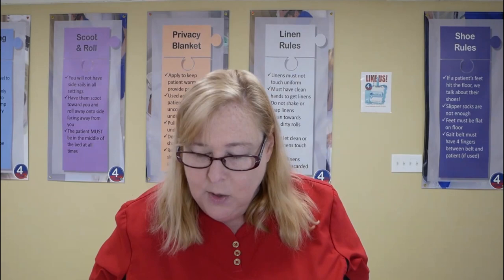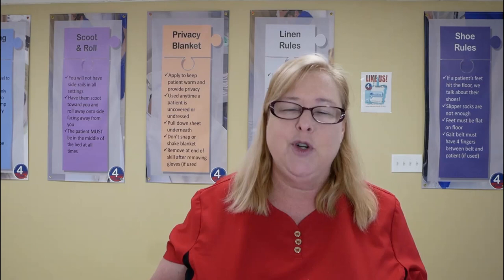Okay, so what if there isn't a bag in the restroom to place a catheter that has come out of the patient? What are some other places we could put the catheter? I'm going to answer that question in two different ways. Number one, if there are no bags available, just grab a bath basin and put it in there. Just don't put it directly on the floor. If there's a shower in the bathroom, then you could probably put it in the shower. But I would try to keep it off the floor, you know, put it in something to rest it on the floor.